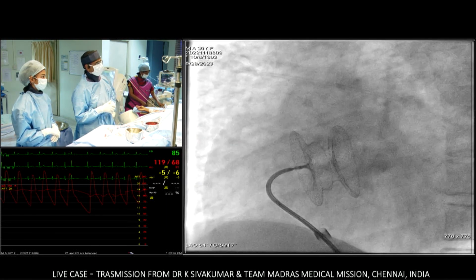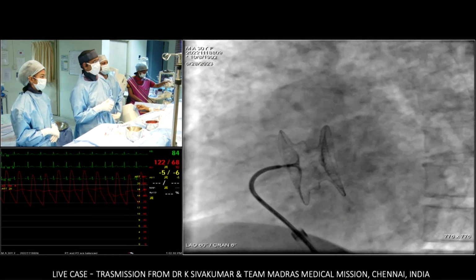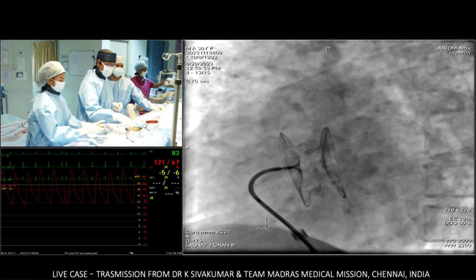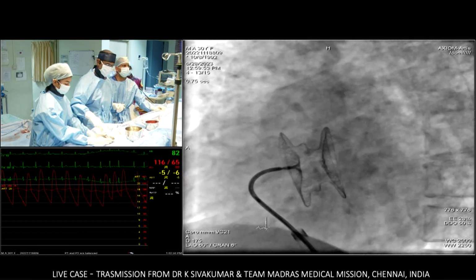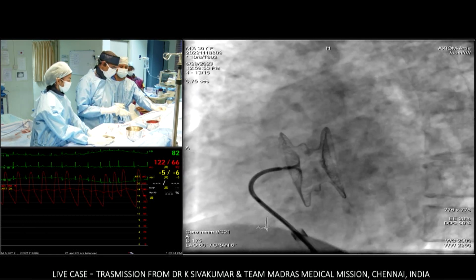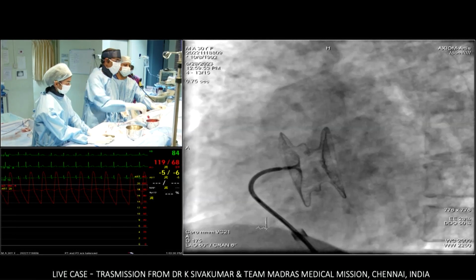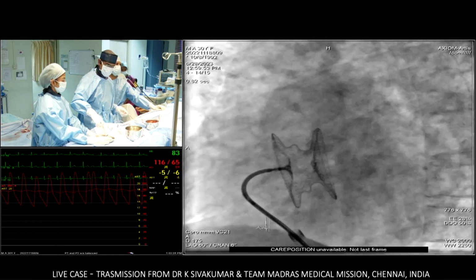Further. So here's a stupid question, Shiva. Which waist is in which defect? I will show that now with a contrast angiogram, with the injection through my sheath, and I will try to profile the septum primum below and the septum secundum above. Go to cranial now. Retain this position, but go to cranial.